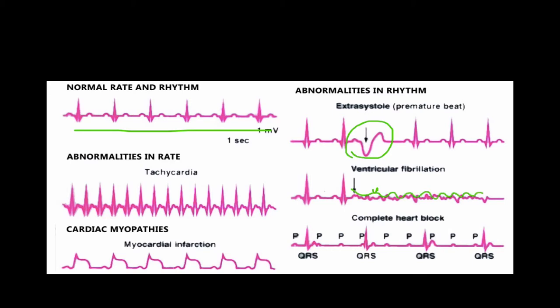Here we had two normal heartbeats, and then all of a sudden we have this kind of busy work. So this is the ventricle not able to kind of restart itself.